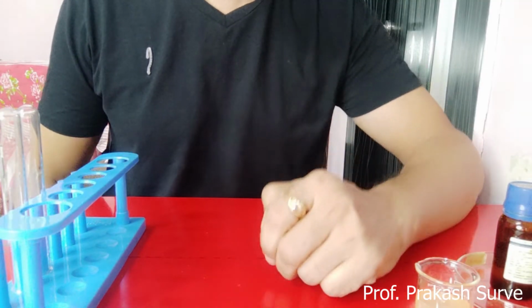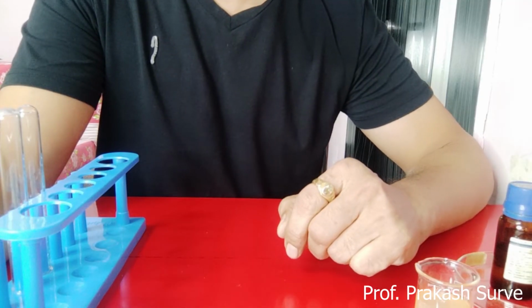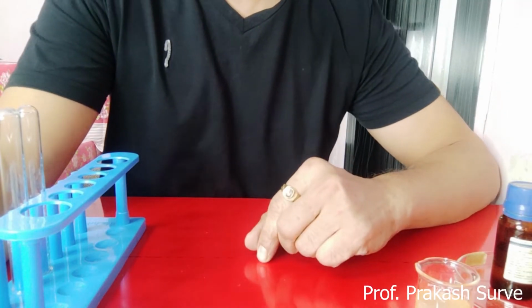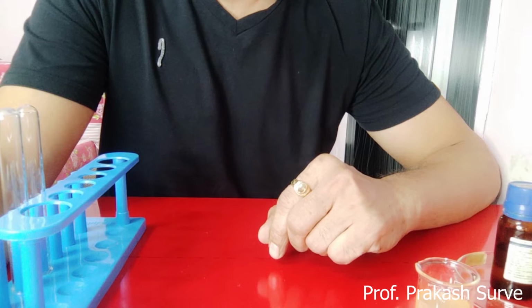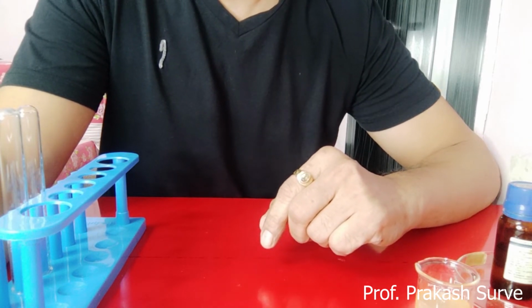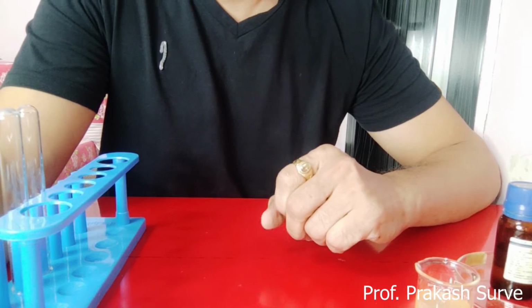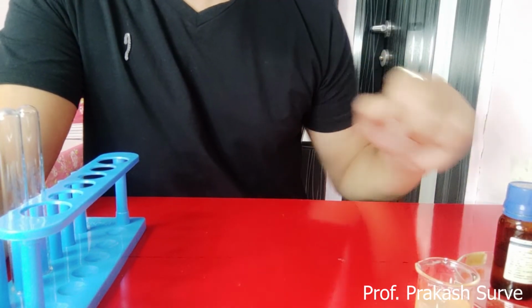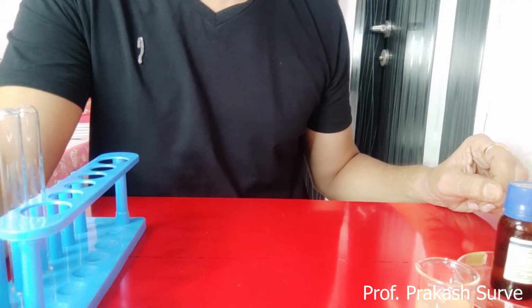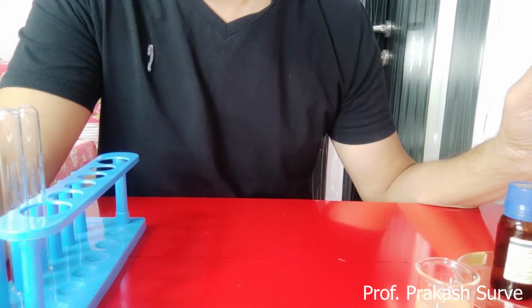It should remain in the body, it should not get excreted. As it gets excreted, it means there is a problem in the kidney or urinary tract, or the person is taking a high protein diet, or sometimes in the case of a pregnant woman we also find albumin in the urine sample. That is considered abnormal.